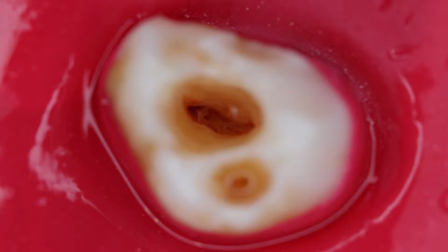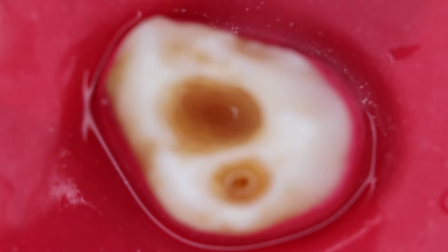And this is the time we are going to introduce the GG drills to enlarge orifices. Once done, you see now the visibility has reduced because the debris has accumulated.